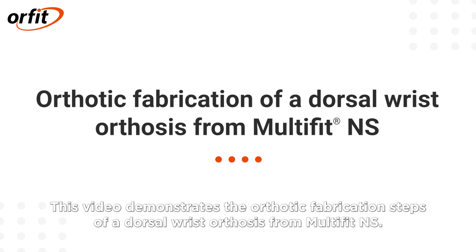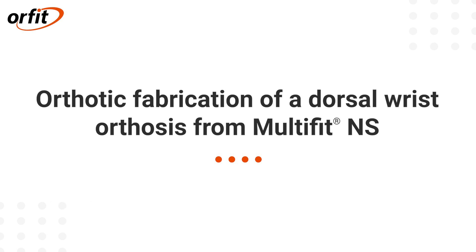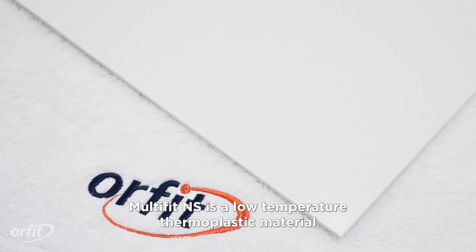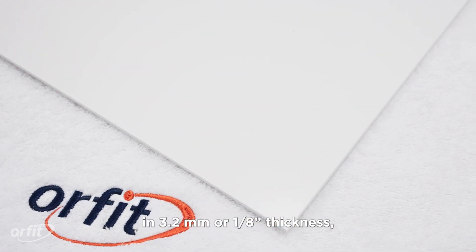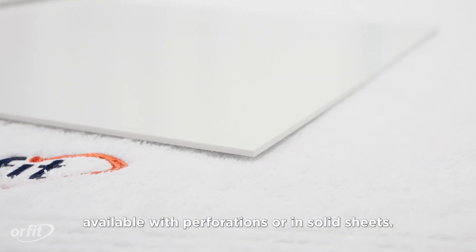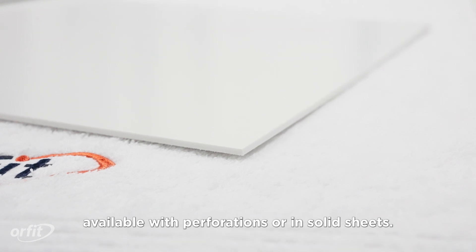This video demonstrates the orthotic fabrication steps of a dorsal wrist orthosis from Multifit NS. Multifit NS is a low temperature thermoplastic material available in 3.2 millimeters or 1/8 inch thickness, with perforations or in solid sheets.